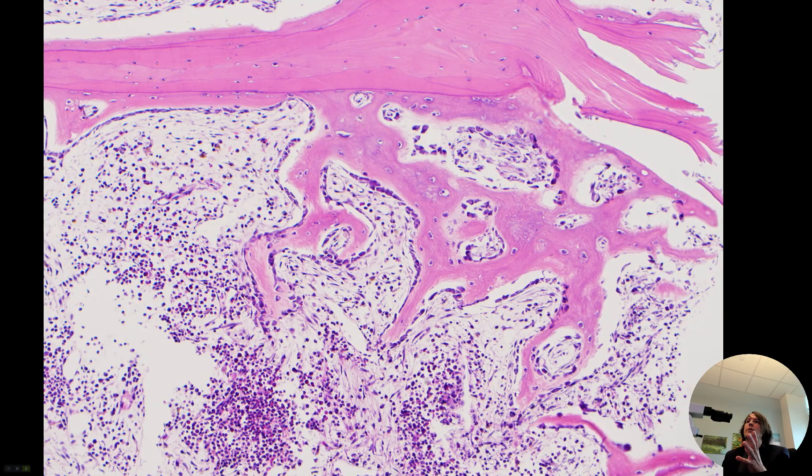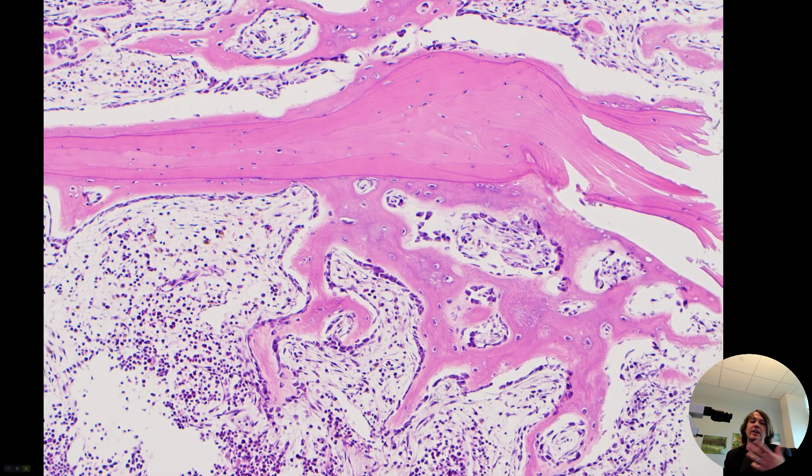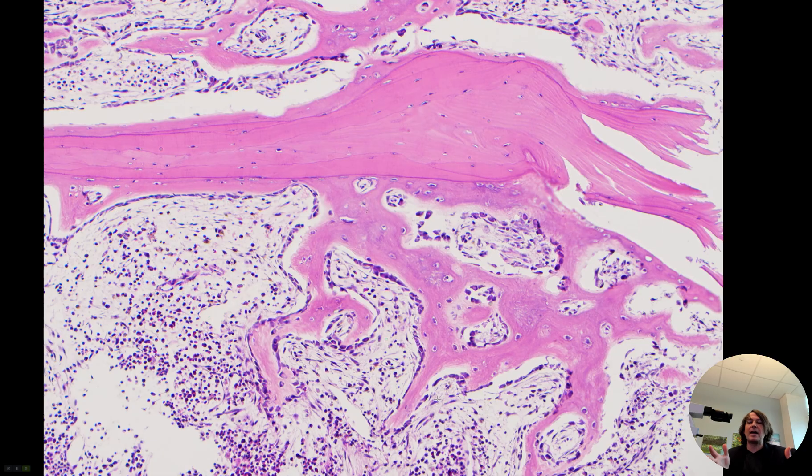I thought this was a really nice example showing both the normal native bone that preexisted prior to the fracture and the new woven bone that's being laid down. If this had been left there, like in a fracture, as the fracture ages and repairs, this new woven bone will eventually get remodeled and will eventually look like this lamellar bone over time. So if you break your arm or your leg, you're going to see a ton of this reactive new woven bone being produced to seal the two sides of the bone back together, and eventually that gets remodeled and turned into lamellar bone, just like the rest of the bone.